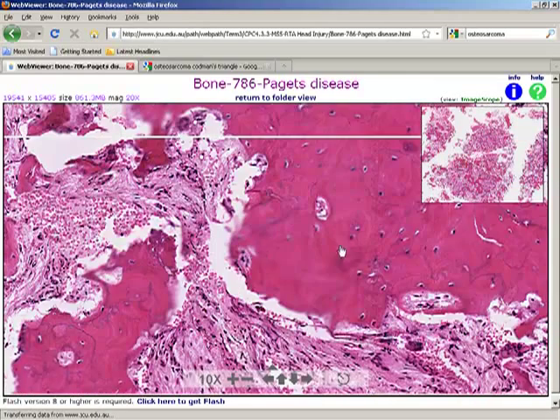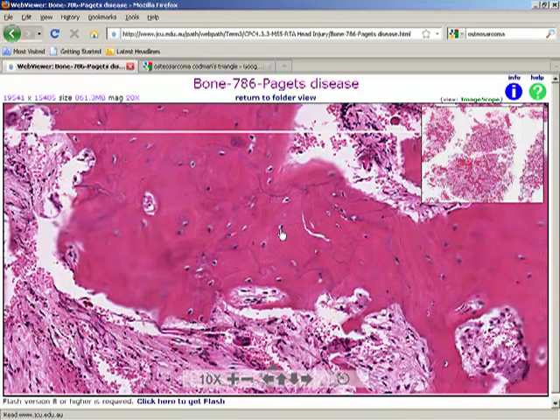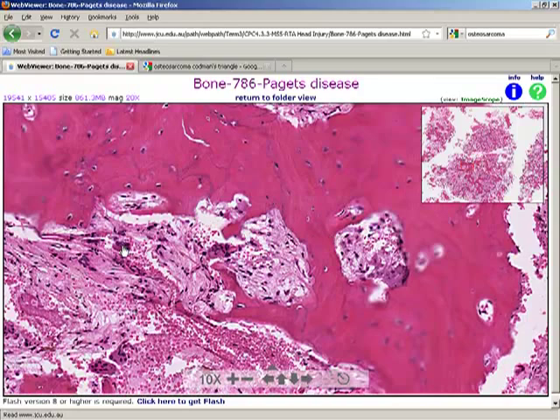Now, this is the microscopy from a Paget's disease bone, the trabeculae. What you see is a mosaic pattern, irregular geographic patterns of blue and pink lines. And you will see the osteoblasts, osteocytes irregularly placed, just like in a woven bone. So, it's all woven bone everywhere. And see the markedly increased osteoclasts.